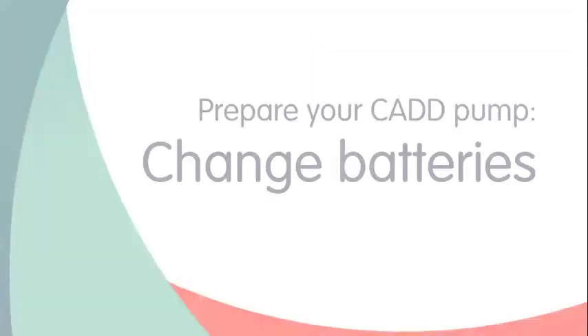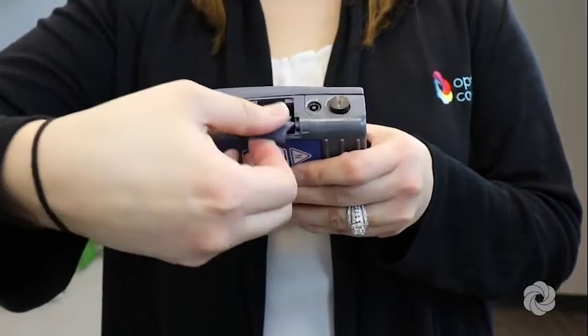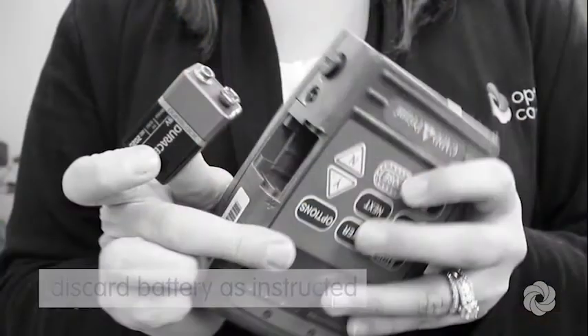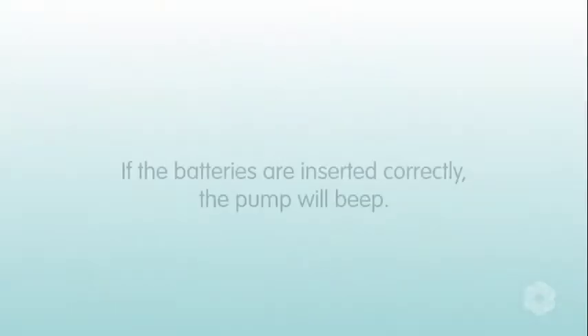Next, change the batteries as directed. Locate the battery door on the right side of the pump. Press the white button and slide the door towards you. Remove the used batteries and discard as instructed. Then, insert the new batteries silver prongs first. If the batteries are inserted correctly, the pump will beep.